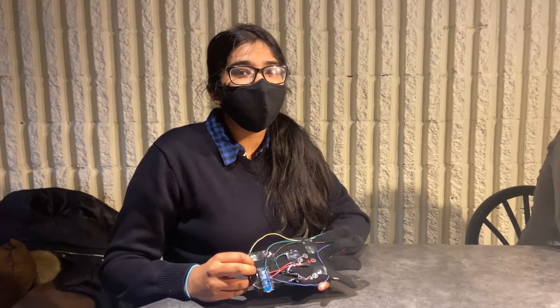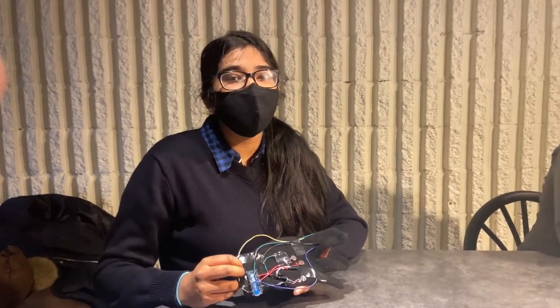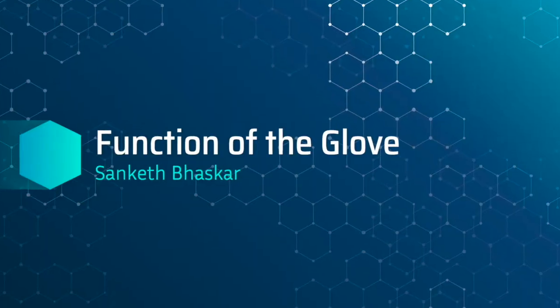The Chroma-Glove is an accessibility tool for visually impaired people. It can be used recreationally, such as to understand your surroundings, or it can be used when color differentiation is an absolute necessity. The Chroma-Glove is powered by an Arduino Nano Every, which we coded on our laptops and then uploaded the sketch to the board so that with the power source, the glove won't have to be connected to the laptop to actually run. The light sensor in the fingertip of the glove returns an RGB value, which is the intensity of the colors red, green, and blue.